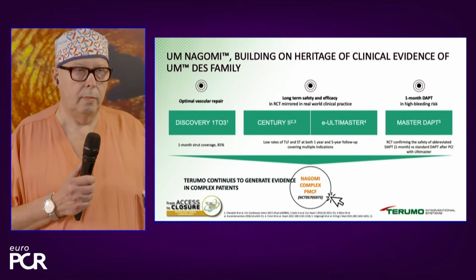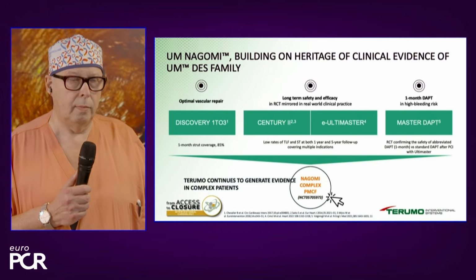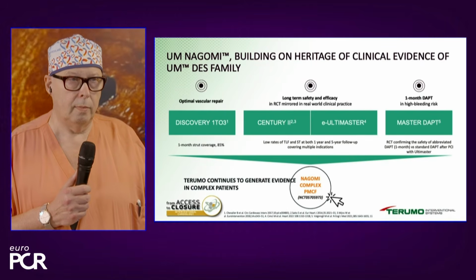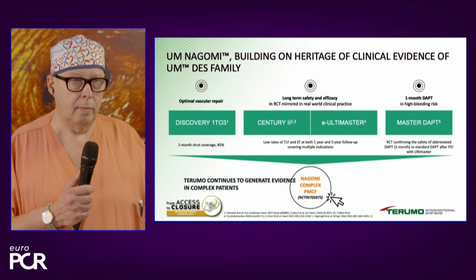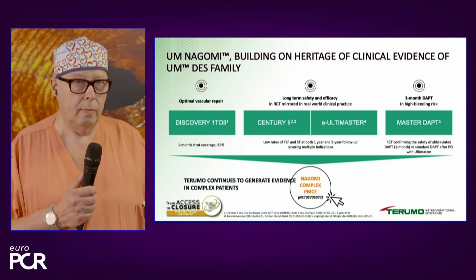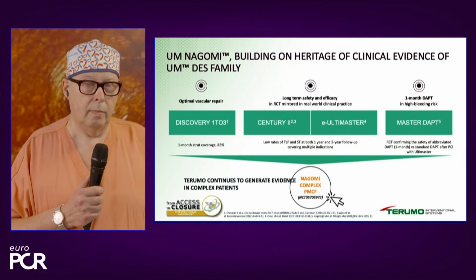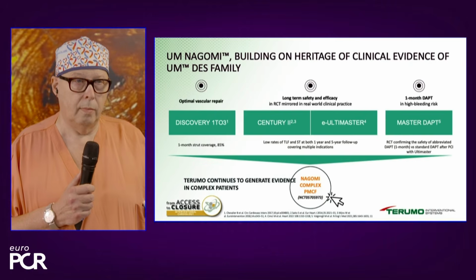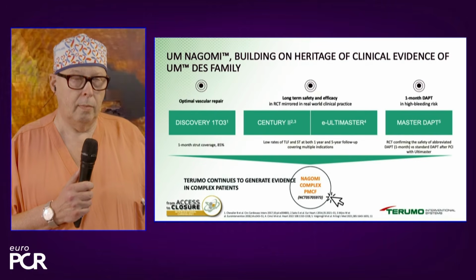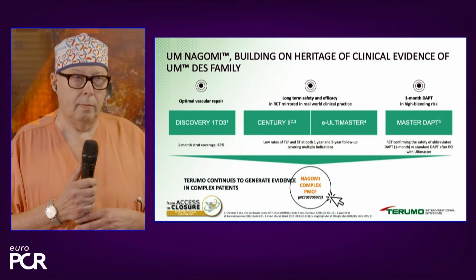Bernard, we see you, and congratulations again on the excellent step-by-step demonstration of provisional. Our goal, as I said, was to discuss available evidence and then the planning of a new study. So what is the brief heritage and clinical evidence that the Ultimaster family has so far?